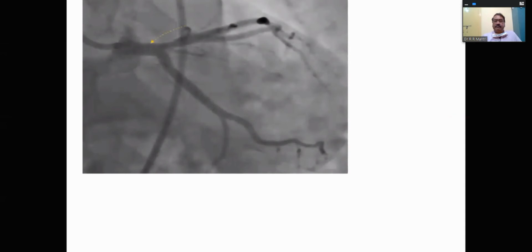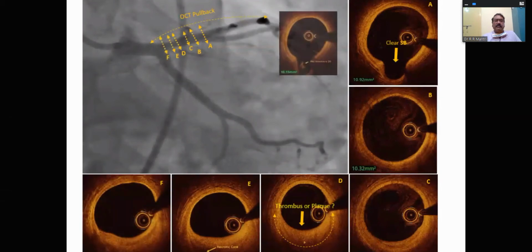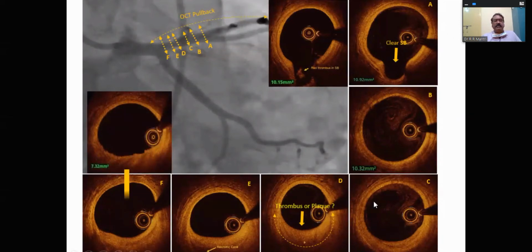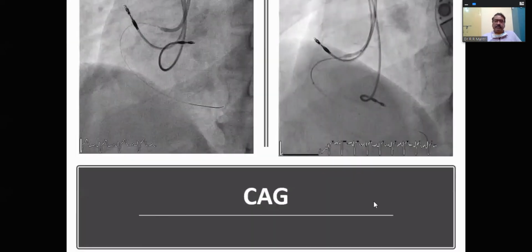And these are the comparative pictures. So initially, there was thrombus at the site of the side branch, no thrombus now. And similarly, where there was marked thrombus, there is an increase in the lumen area from the previous. Case two is a 62-year-old male, diabetic, hypertensive, post-pacemaker, admitted after 15 days with a history of chest pain. ECG was inconclusive due to paced rhythm. Troponin was grossly elevated. Echo showed wall motion abnormality with EF of 48.